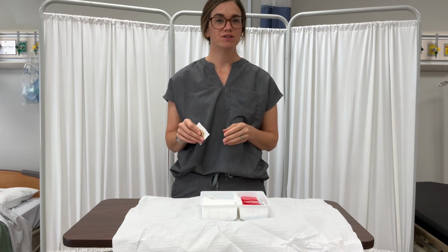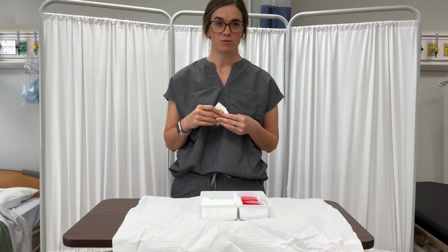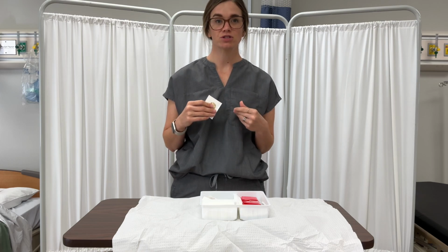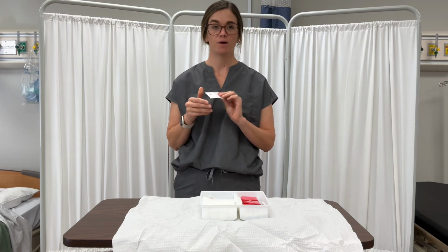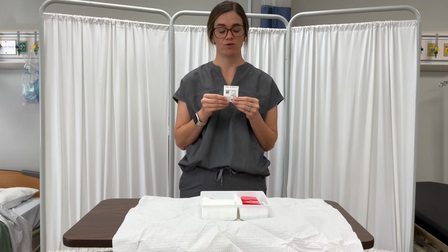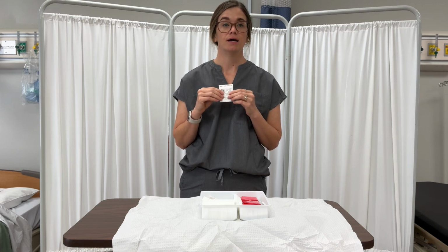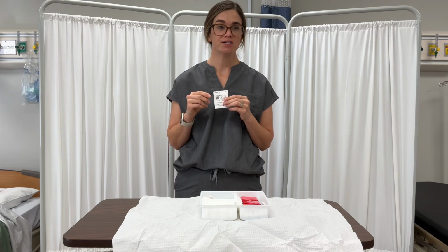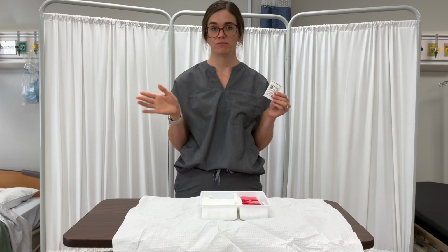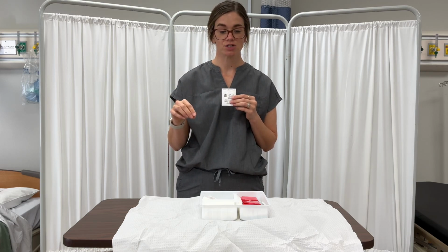So this is specifically for upward mobility. For their dropping in, we don't have the surgical sponges for you to open in your hand, so we're going to use something different. Again, if you're dropping anything into a sterile field, you need to make sure that it is labeled as sterile. This is going to depend on the procedure that you're doing with your patient, and you could have to drop in various things. We're not going to open up a field. We've already done that in a different section of the video.